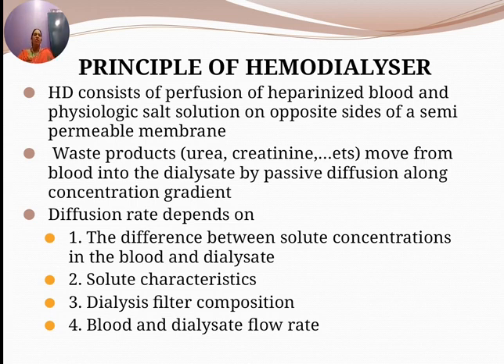The diffusion rate depends upon the solute concentration in the blood and the dialysate, solute characteristics, the dialysis filter composition, and the blood and dialysate flow rate.